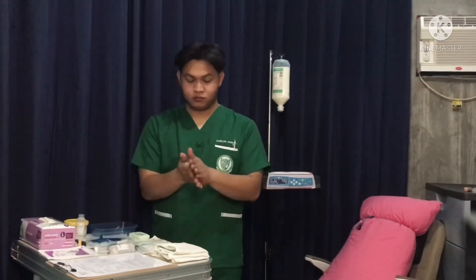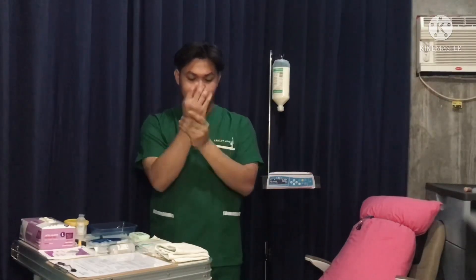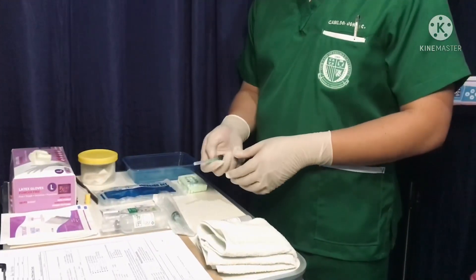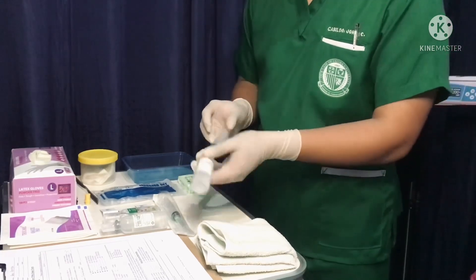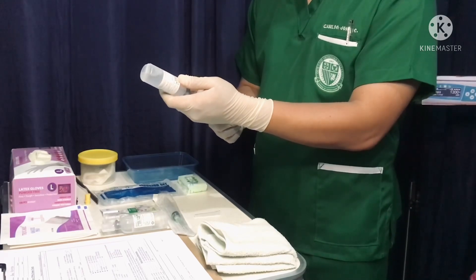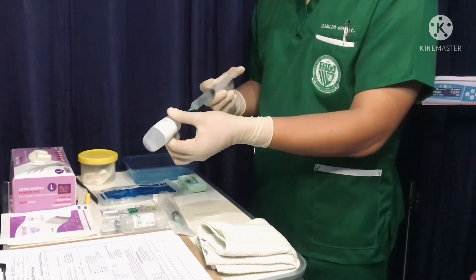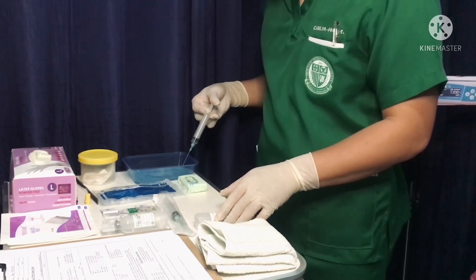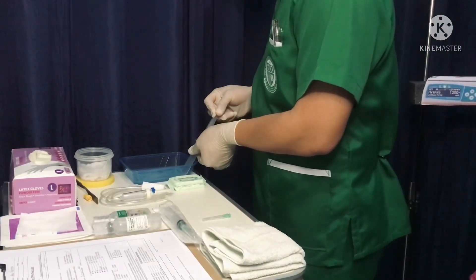Perform hand hygiene using soap and water or alcohol hand rub. Now, don your sterile gloves. Next, pour the saline into the sterile tray. Draw off the saline and set it aside.